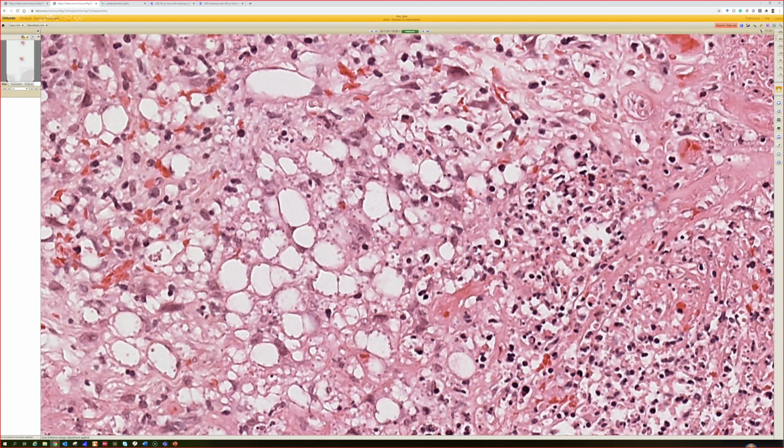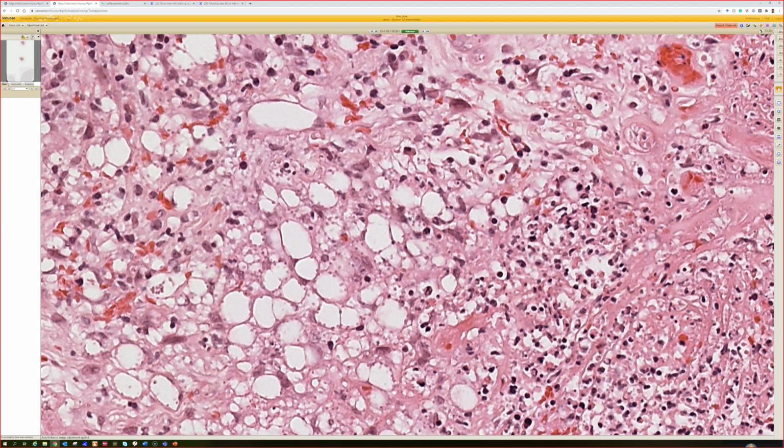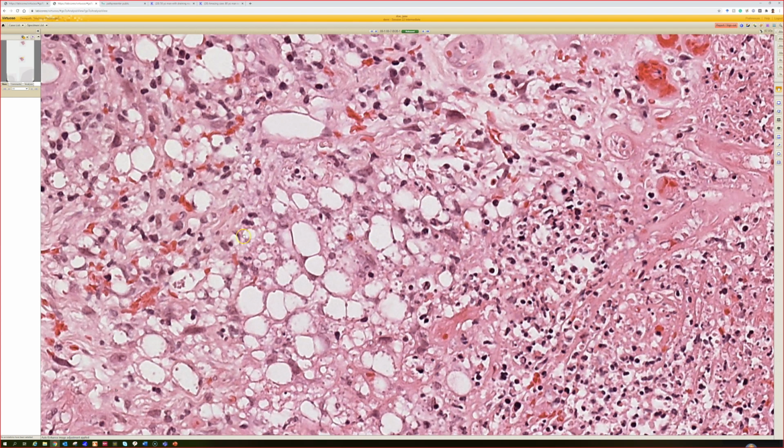What someone told me, Dr. Bobby Pritt, who's an infectious disease pathologist at Mayo Clinic, really smart. Her name is also Parasite Gal online. You can follow her on Twitter and Instagram, and she's got a wonderful blog about parasites and infections. She said that usually for the kinetoplast, you need 100x oil immersion to see. And she also mentioned there's a variation of H&E that has silver addition to it that makes the kinetoplast stand out. Other times people also talk about Giemsa as being positive.